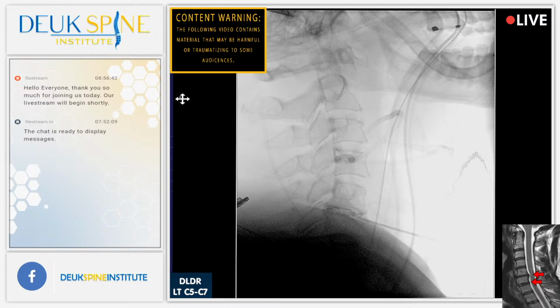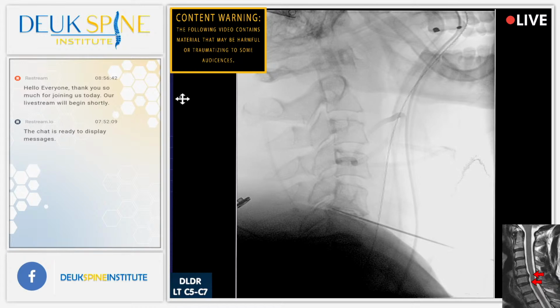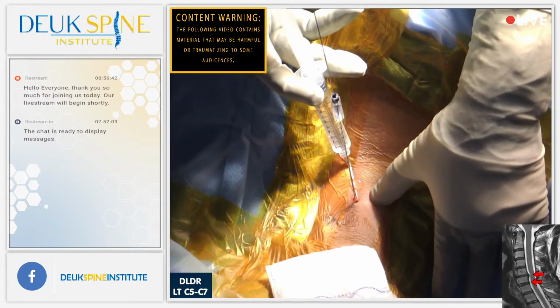All right, the neck is supple. I've had my anesthesiologist, Dr. Berndes. Not only is the patient asleep, but also they are what we call chemically paralyzed. Chemically paralyzed means that we have put in medicine to relax their muscles. And that's important because you can't do this particular surgery, cervical spine endoscopic surgery, in my opinion, without chemical paralysis.